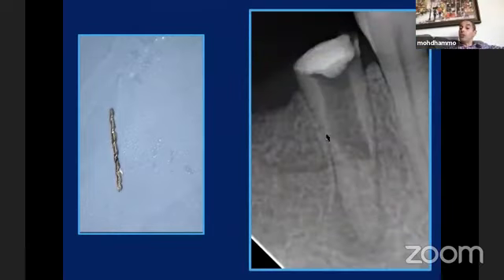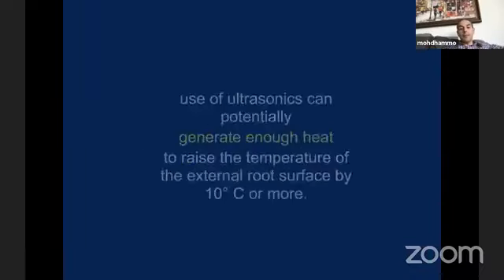Like here, I'm not a hero because I removed a broken instrument. You are a hero if you preserve the structure of the tooth. So our colleague here removed the broken instrument, but unfortunately, he destroyed the tooth. You can see here, he removed a lot of precious dentine, and now the tooth is so brittle.